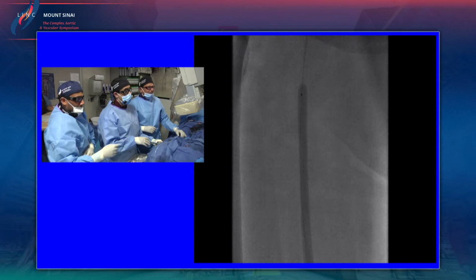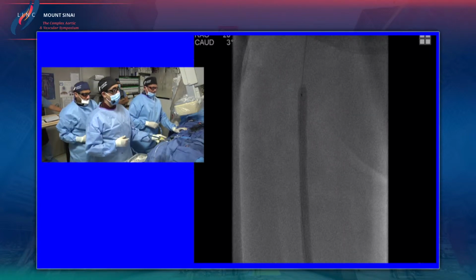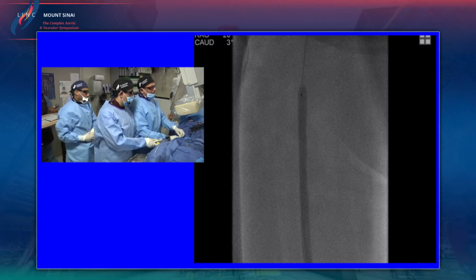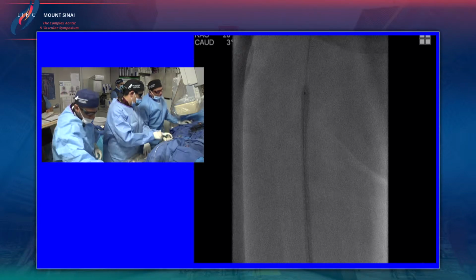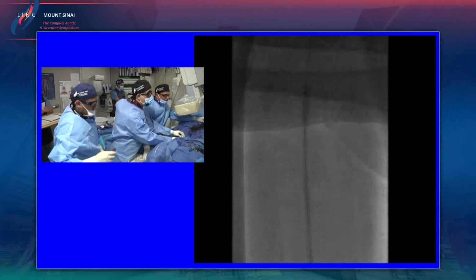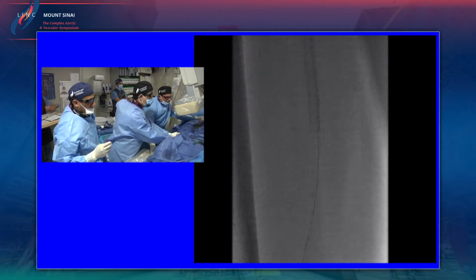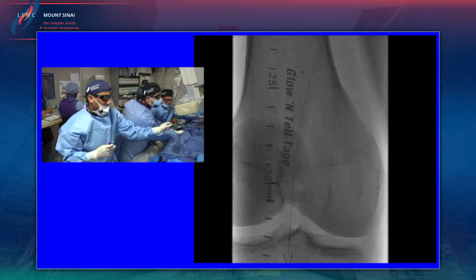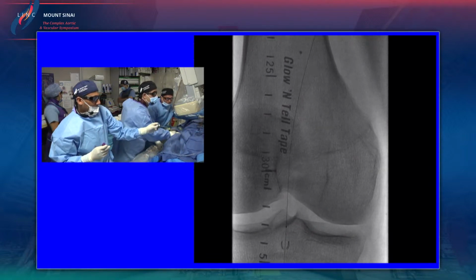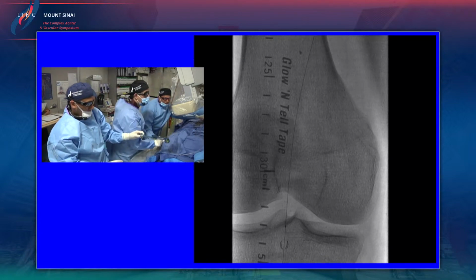Okay, down. Heart rate, guys. All right. So he is responding with a little bradycardia. I know, but he went down a little bit lower. So we're just going to walk this out and take a quick picture. And then if it looks good and we don't have dissections, we're probably going to scaffold this with a Zilver, Chris. That was our initial plan. We'll see how it looks. So always when you walk this stuff out, worried about thrombus, watch the filter as you're coming out. I think it's very, very important to do that.